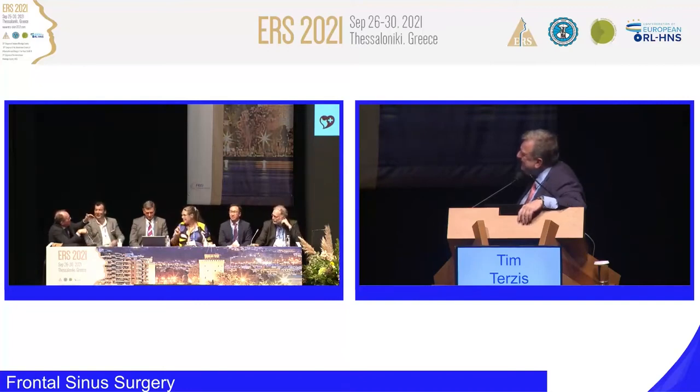It's not easy. It's very high up, and the diameter, even when you do a type 3 or you take the internal beak, it's hard, and you get it away from the pedicle, but then you cannot grab it because the diameter is too deep. It's not easy. Yes, Phillipe?